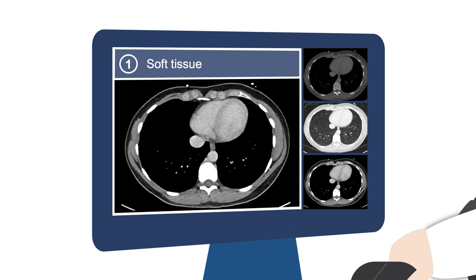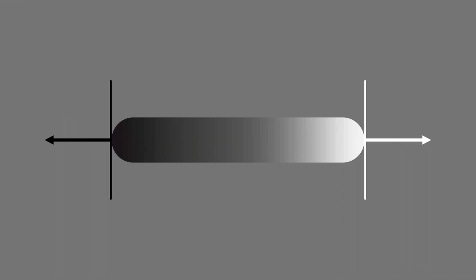In this lesson, we are going to dive deeper into those window settings and how they relate to attenuation values. The window setting refers to two parameters: the window width, which determines the range of grayscale values that the image will display, and the window level, which defines the center point of that range.